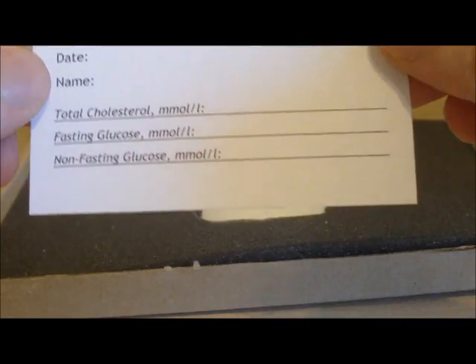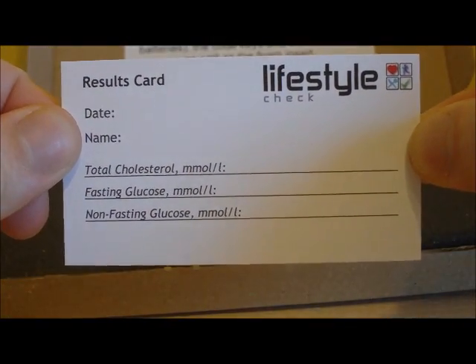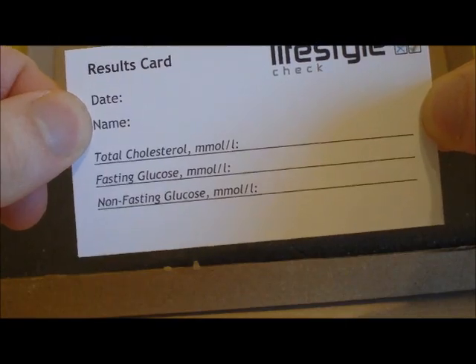You will also have a lifestyle check results card, which you can write on and keep as a record of your results. Underneath your foam inserts you will find a sticky returns label with the postage prepaid. You are able to just unstick that and pop it on the box to send the equipment back to us, and also your invoice, which is yours to keep.